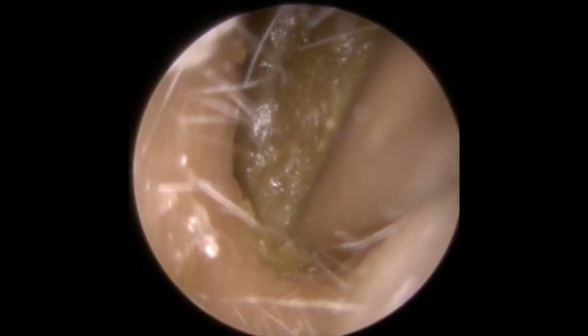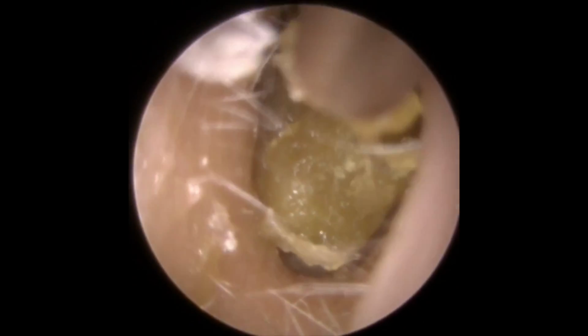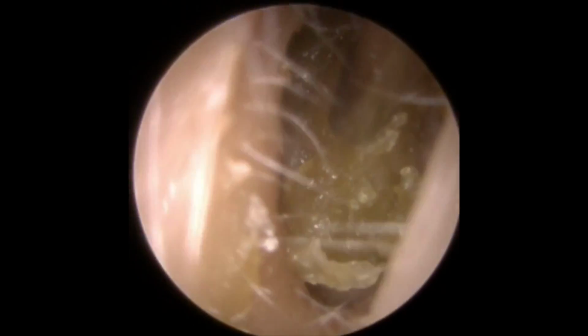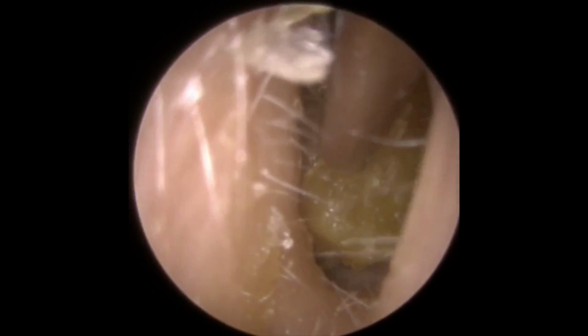This lady was an absolute star. She did so well. She was so nervous about going anywhere to have this done other than the ear, nose and throat specialist. We reassured her we would be as gentle as we possibly could, and we would get it out. But yeah, you can see she sat through quite a bit. We're constantly in and out of the ear with this at the moment. Working on the bottom here, we've broken some pieces off, so we've made this piece a little bit smaller.